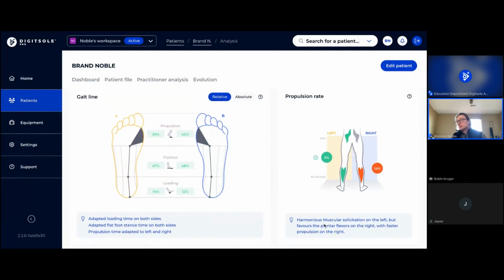So again, musculoskeletal low back pain strain predominantly displaying on the right-hand side of the back. Now, what we're able to see here is how the plantar flexors or gastrocs work in harmony with or against the hip flexors. So as a protection factor for me specifically, I was having a harder time engaging my hip flexors. So what the algorithm is able to do, bringing in multiple pieces of the analysis, is really analyze where one is working harder than the other.